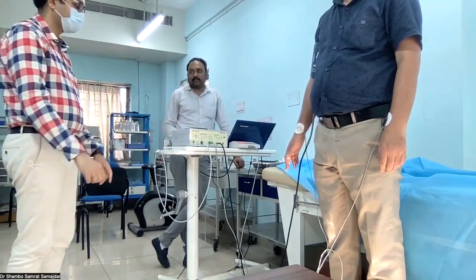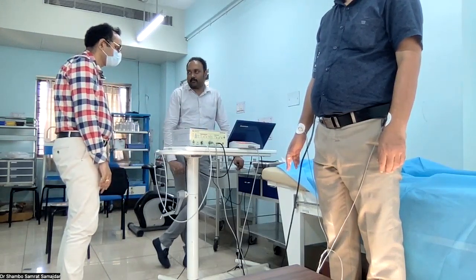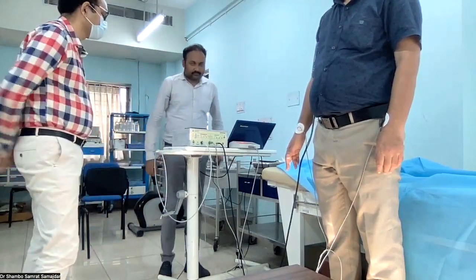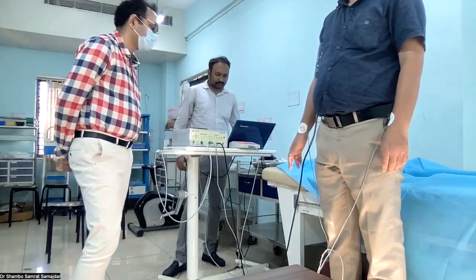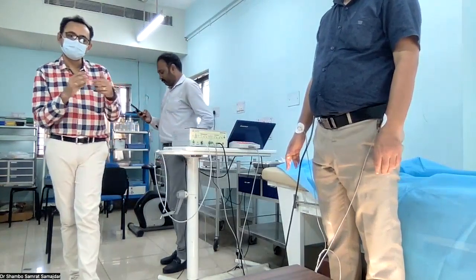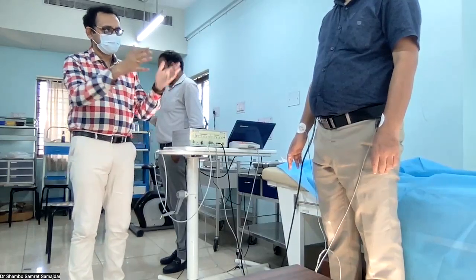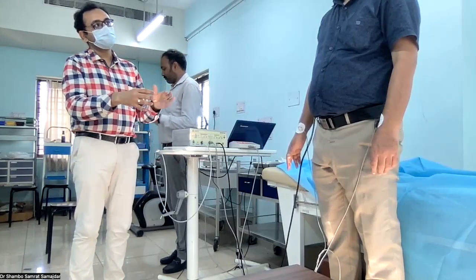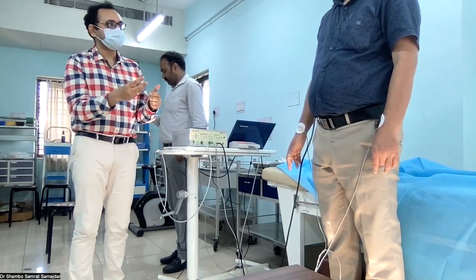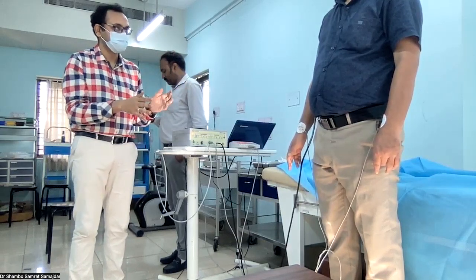Yes, for the further reading, ask the patient to be standing for 1 minute. After 1 minute, the machine will start taking the reading automatically. So patient will remain standing. So there is some lacuna here. Actually, we want a machine which can give the blood pressure reading immediately after standing. For that, we need some non-invasive blood pressure monitoring which could give us an immediate report. But this type of machine is devoid of that facility.